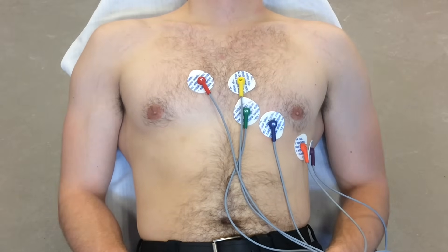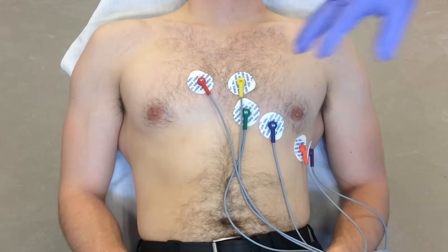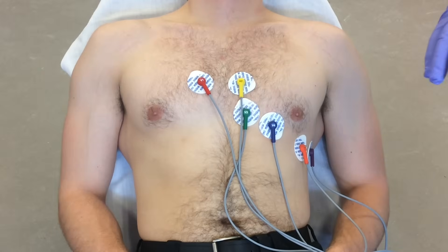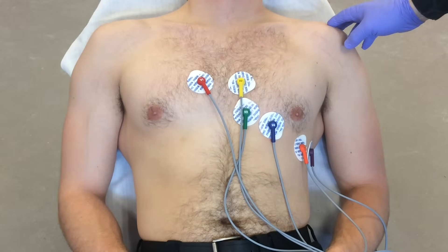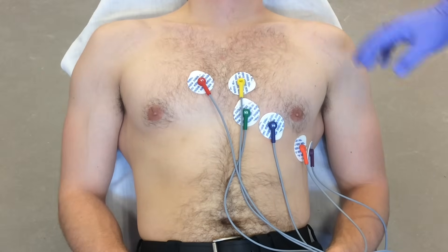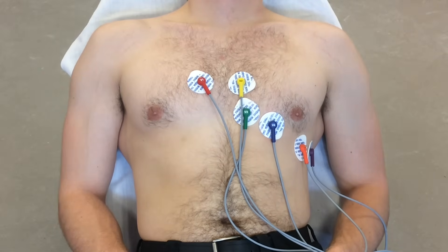The limb leads I typically put on the wrists and the ankles. You can put them up on the shoulder, but I generally try to avoid large muscle mass because you get muscle artifact.